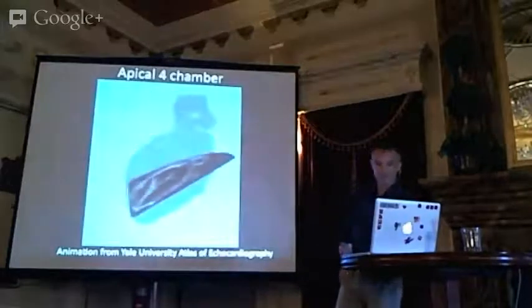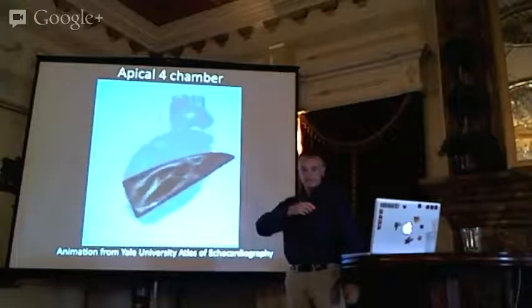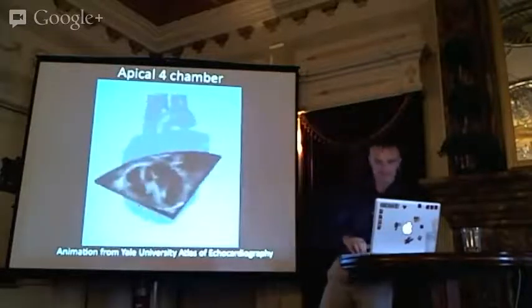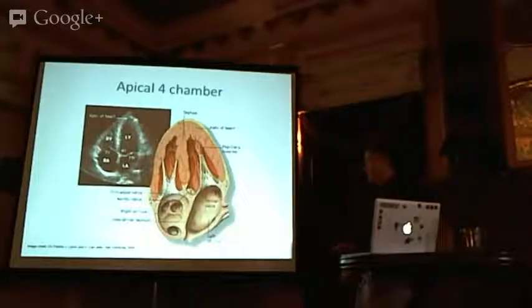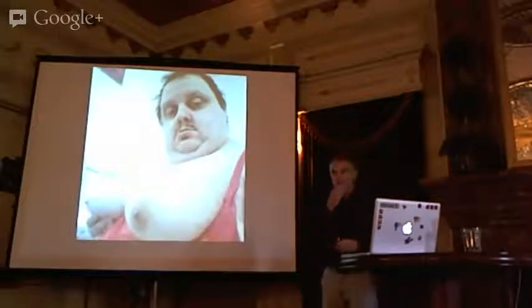Okay, and then the apical four chamber view. So we've moved the probe from here, rotated it 90 degrees clockwise. Now we're just sliding down to the point of maximum impulse, and the probe marker is going to be roughly facing the patient's left hand side. We're going to get this view, and this is the one everyone wants to get because it looks like how we imagine a heart in the chest. If you flipped it upside down, you'd see that on a Valentine's card. So you've got the right ventricle, the left ventricle. But personally, I find this view one of the hardest to get, particularly if patients have lung issues. So if you had a patient like this, it would be potentially quite difficult to get a good apical four chamber view.